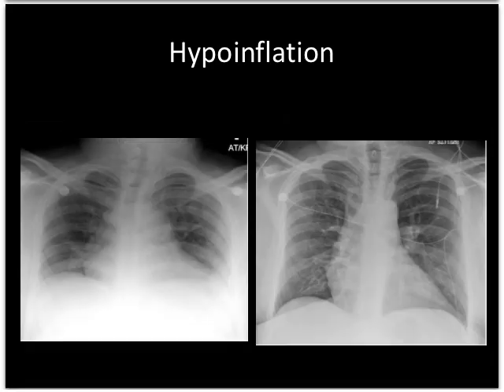Just to show you how profound the effects of hypoinflation can be: the patient on the left has taken a very low inspiration — you can see how wide the mediastinum looks and how crowded the vascular markings are, making it really difficult to see subtle abnormalities. The same patient on the right was imaged the next day with good inflation. Both of these are totally normal chest X-rays, but you can see that they look dramatically different.